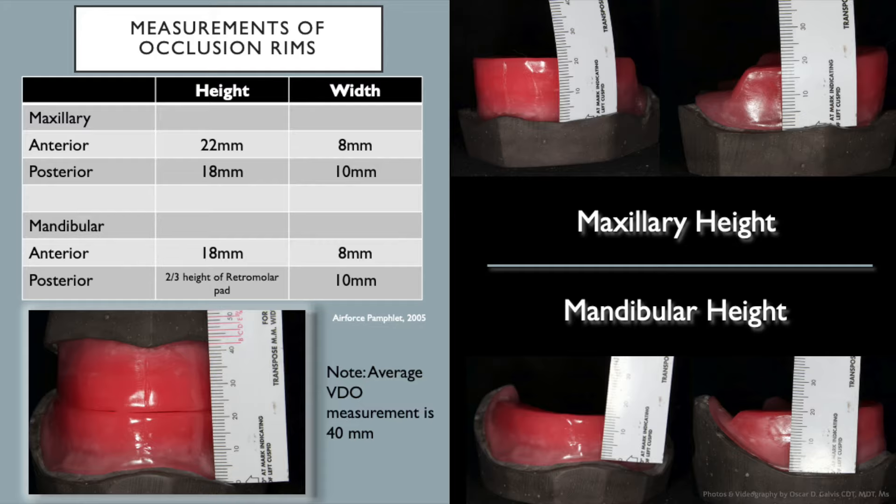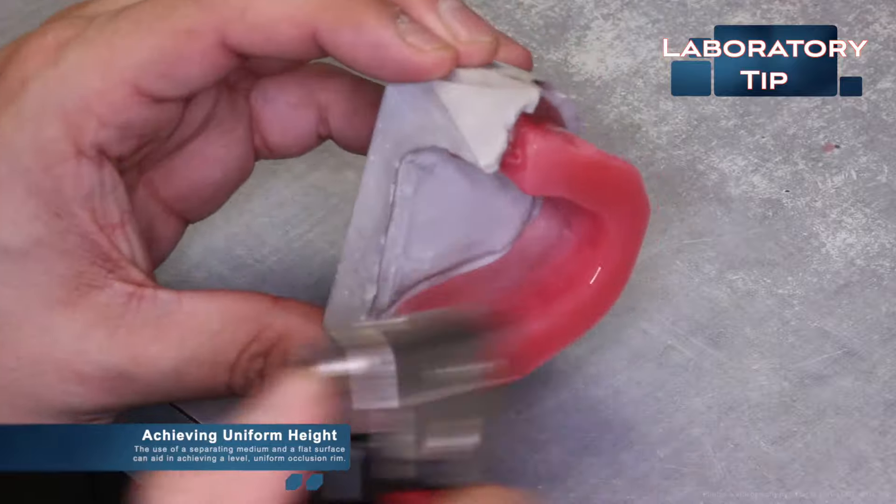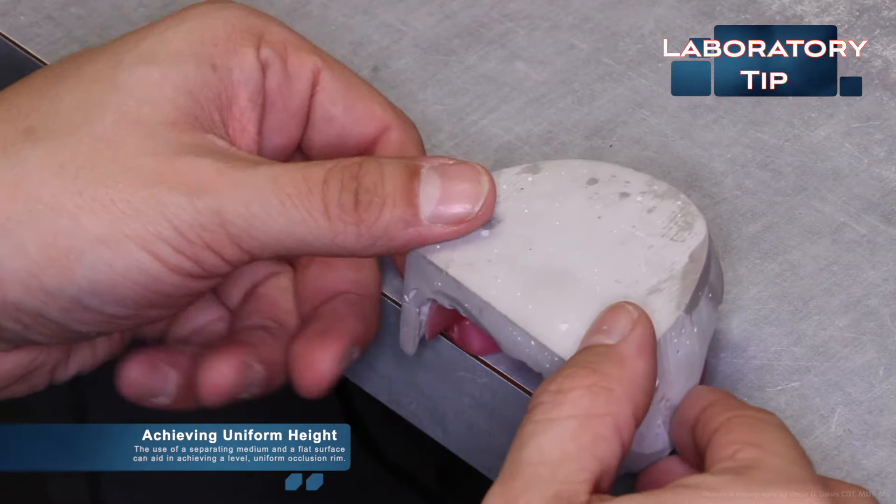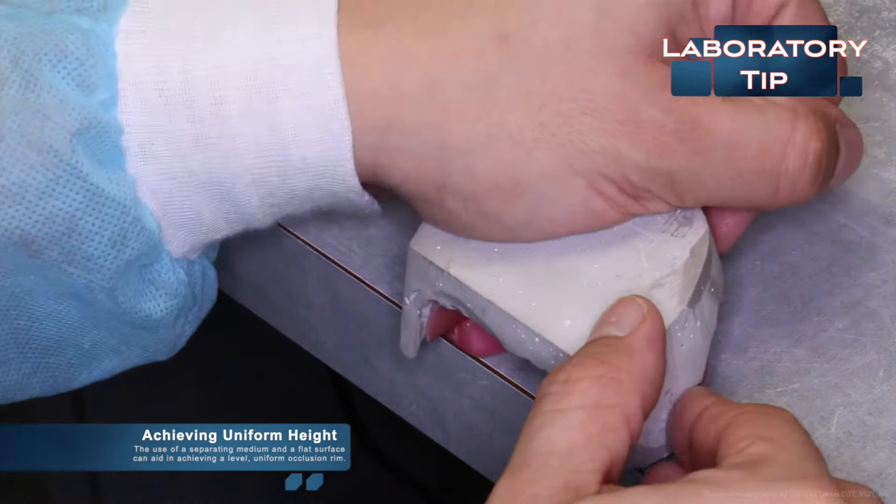Achieving a uniform height can sometimes prove difficult when fabricating an occlusion rim. Use a separating medium on the occlusal surface of the occlusion rim and a flat surface — this can aid in achieving a level, uniform occlusion rim as seen in the video. Once you have reached your desired height, lute the wax to the record base using base plate wax, just as you did on the maxillary.